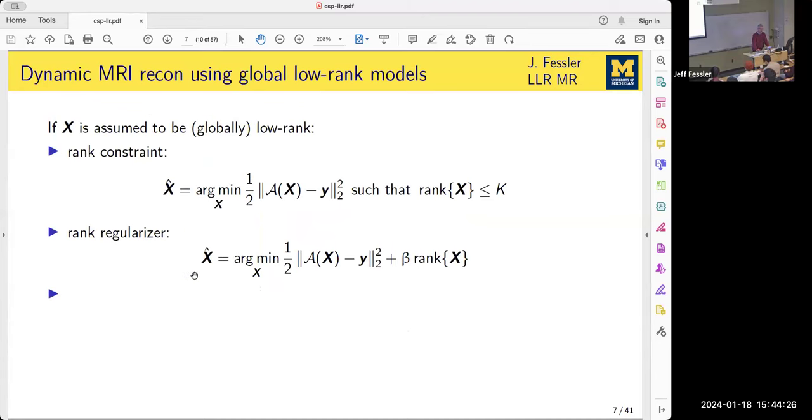Okay, so I'm going to talk. We've got to make some assumptions, and a common assumption, the way it's worded in the literature as well, is that we're going to assume that it's low rank. So we've got this matrix that's space and time. If it's something like injecting a contrast, there'll be lots of pixels that are changing together in similar ways. So it makes sense that that matrix would be what we casually call low rank.